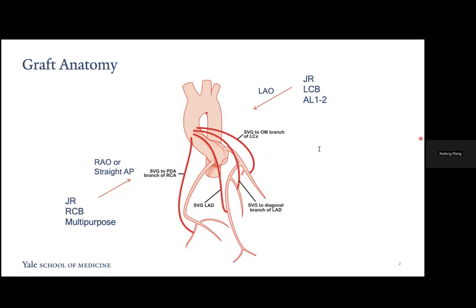Other catheters we see less often: if for whatever reason we go through the right radial artery and we need to engage a LIMA, sometimes we use a catheter called the Simmons catheter, which has a pretty dramatic bend and a long arm that can get you into the left subclavian, and we can wire from there and engage it with an IMA or a JR catheter. I wish I could show a picture here. I meant to copy and paste one onto this slide.